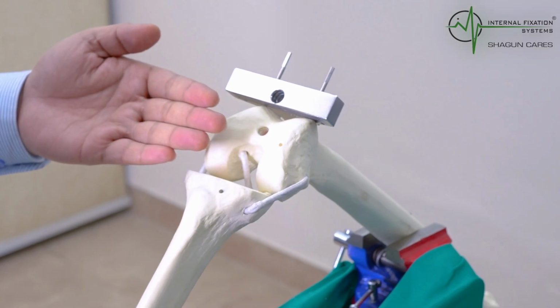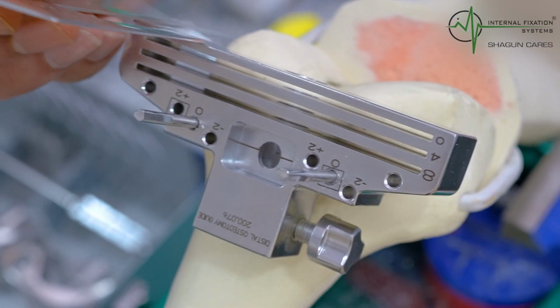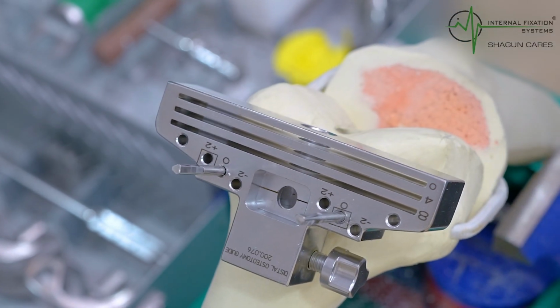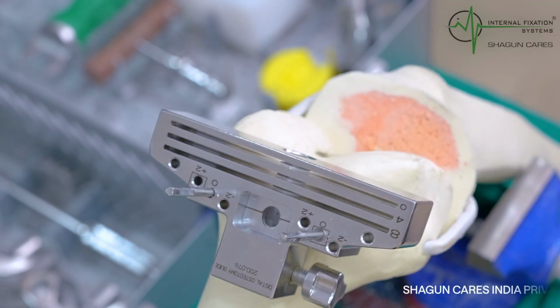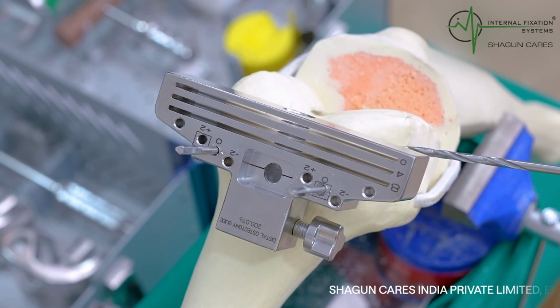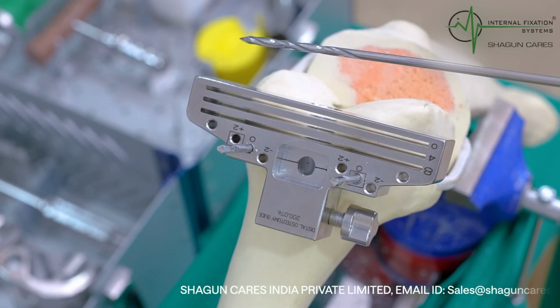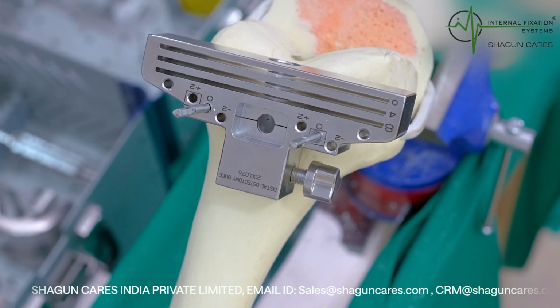The first cut, we are going to take it perpendicular. Now we see that this is going to take cuts on both the sides. You can appreciate that this part is bigger compared to the lateral condyle. That's why we keep a 6-degree valgus cut, so that it becomes perfectly perpendicular.